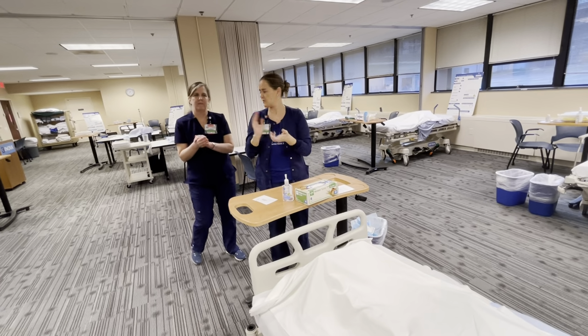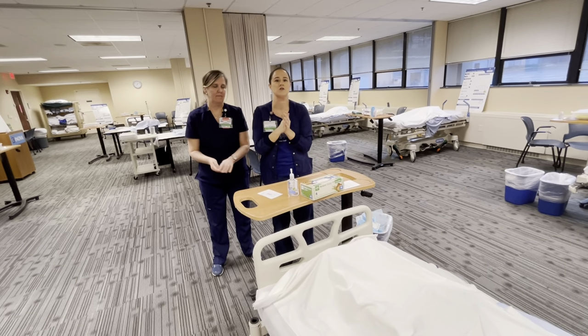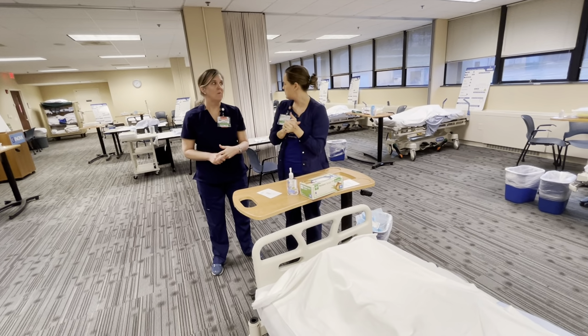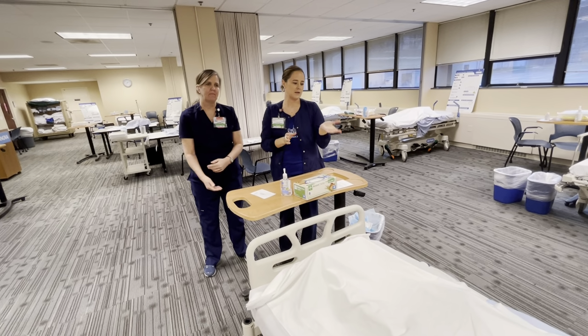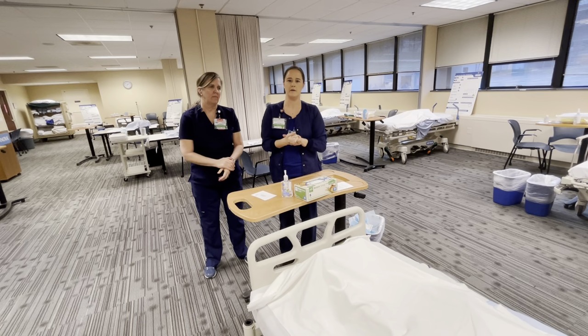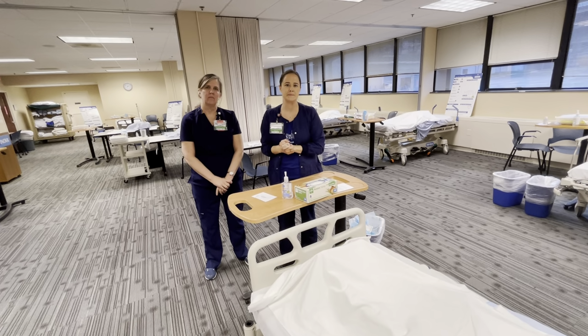Lynn-Ann, we successfully placed the Foley in Mr. Gray. Okay. We got 300. 300, light clear, no odor. Okay, great. We put it in Epic. We also documented it in Epic as well, and he tolerated it fine. All right, thanks so much. Excellent.